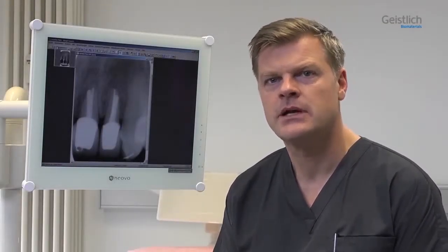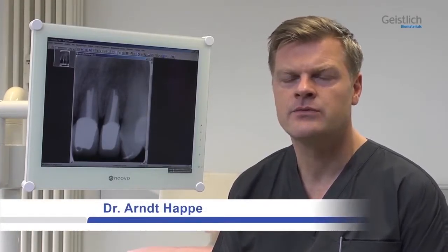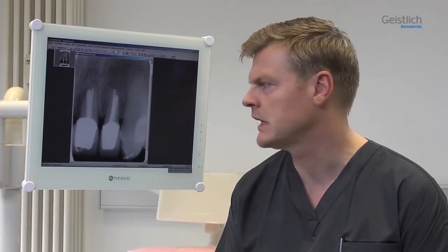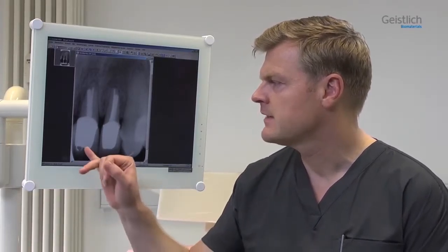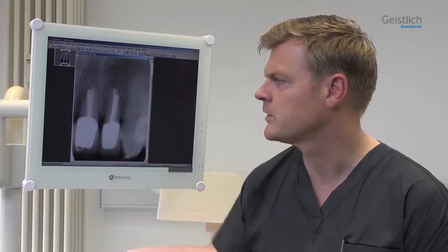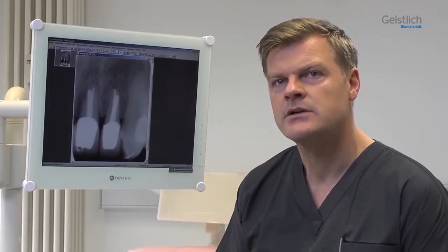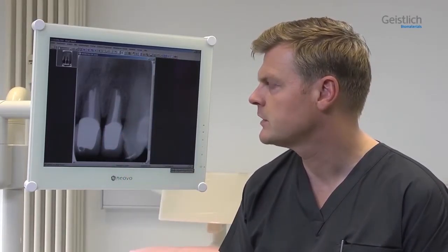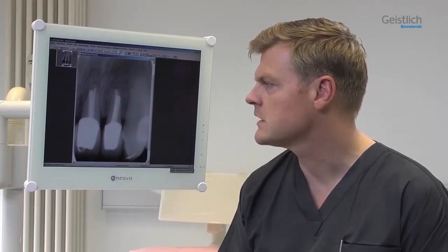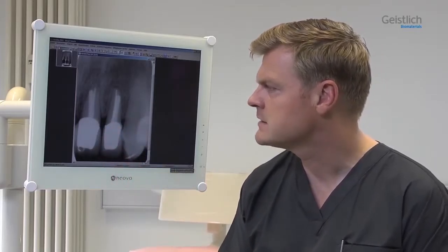This case involves a 48-year-old woman with an unremarkable medical history. The anterior maxilla has been reconstructed with all-ceramic bridges and single crowns about two years ago. As part of this reconstruction, teeth 2-1 and 2-2 were endodontically treated and received relatively large posts. Since then, a longitudinal fracture of tooth 2-2 has occurred and a few weeks ago a buccal fistula was detected. The relevant area is explored with a periodontal probe all the way to the apex and there seems to be no remaining buccal bone. We plan to remove this tooth and to close the gap with a single tooth implant.